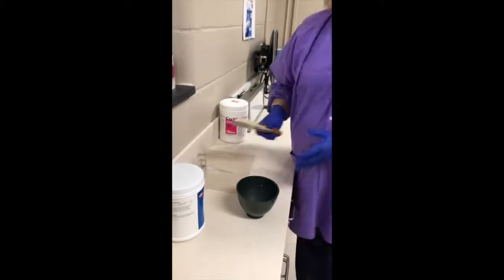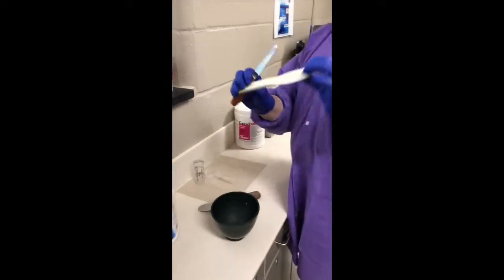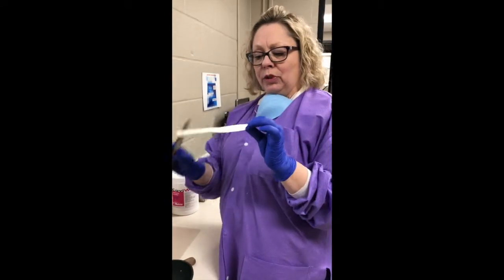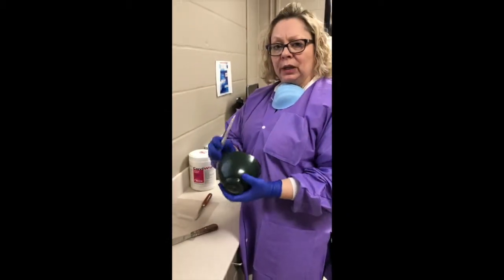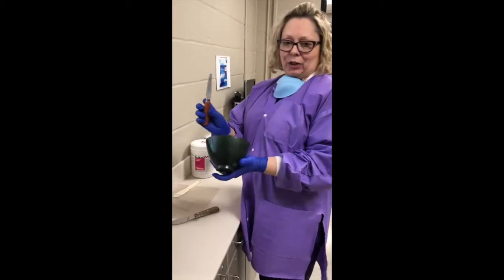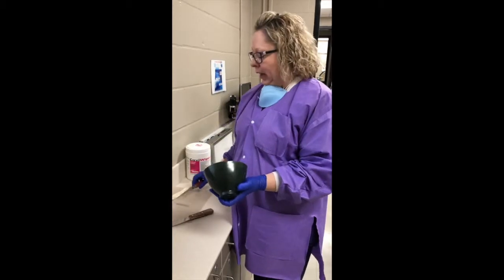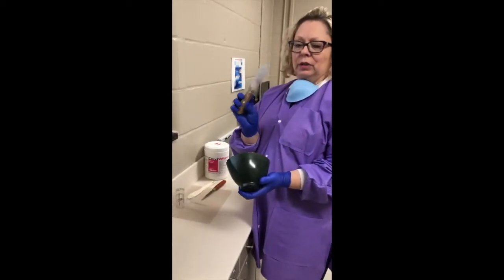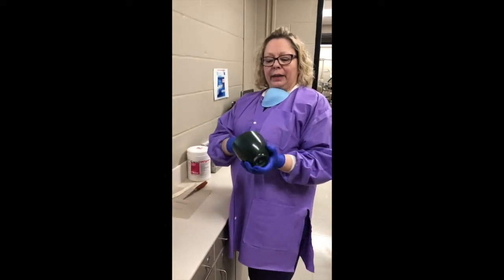There's lots of different types of spatulas that we use in dentistry. There's a plastic one, which is more flexible, so with this being flexible and the bowl being flexible, you can't get as great of a mix of the product. A little skinny spatula like this one will also not be as effective as this, which is our favorite to use to mix alginate material. It's a metal, so it's a lot stiffer and it works really well.